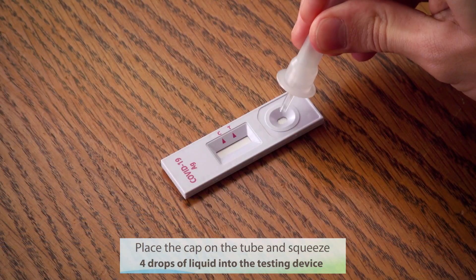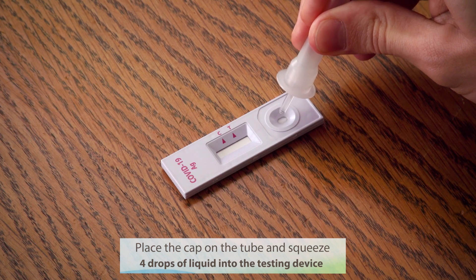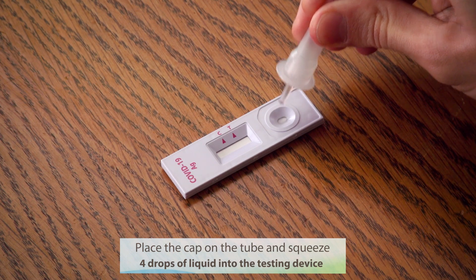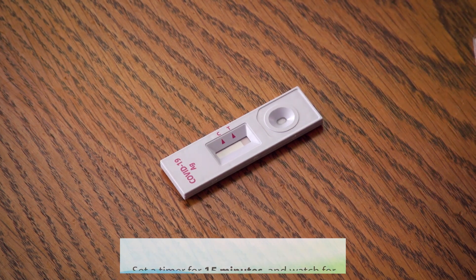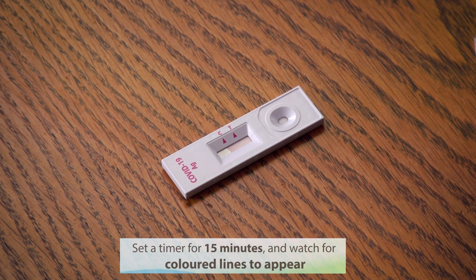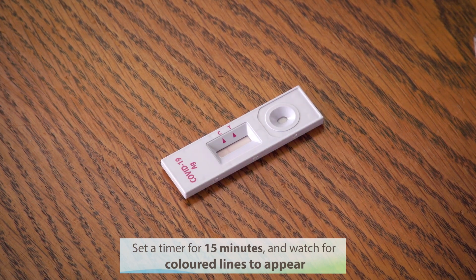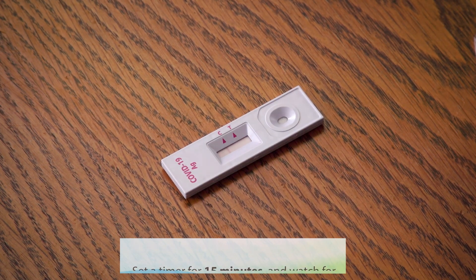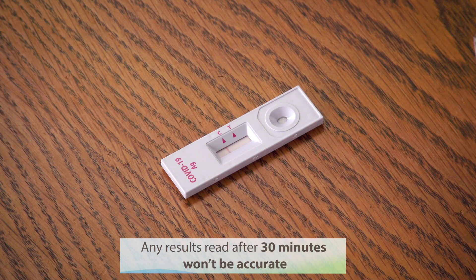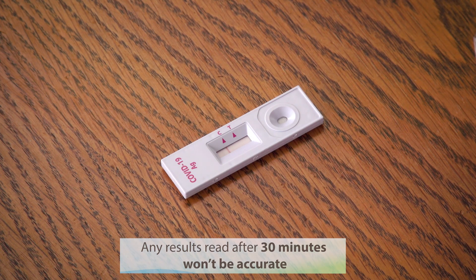Place the small nozzle cap on top of the collection tube and squeeze 4 drops of the liquid into the sample well of the testing device. Set a timer for 15 minutes and watch for colored lines to appear. Any results read after 30 minutes will not be accurate.